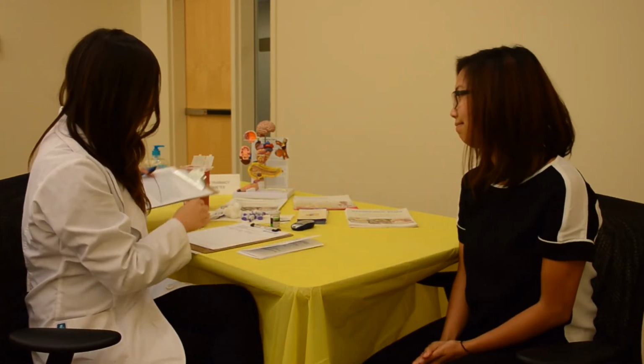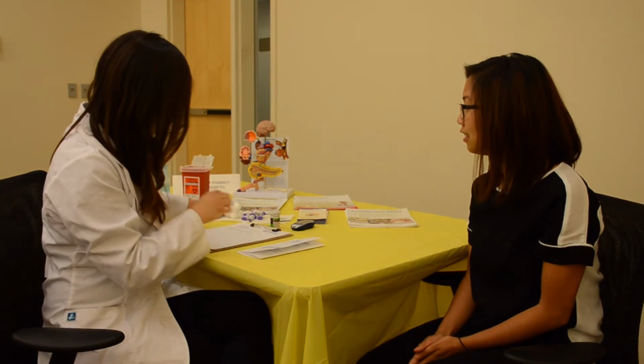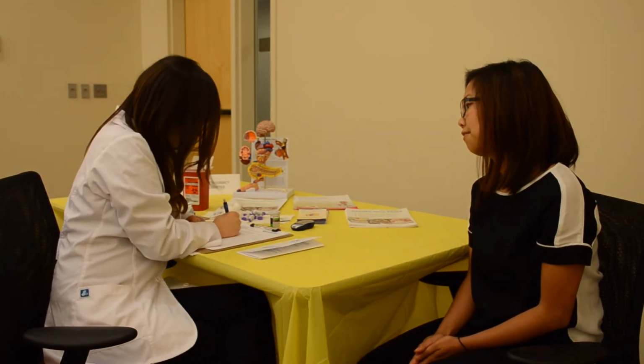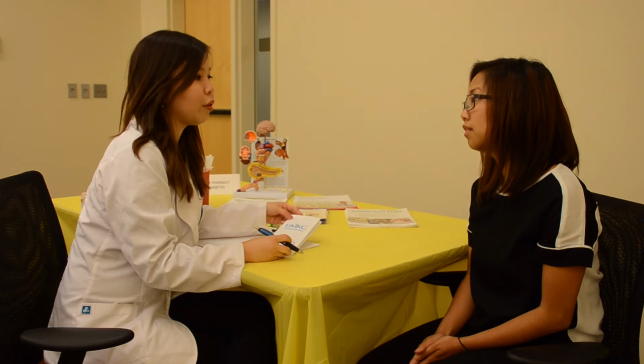Thank you, Julie. I'm going to ask you a few questions. Have you ever been diagnosed with diabetes before? No, I haven't. Okay. Have you eaten anything in the past 8 hours? No. Alrighty. So before we do the finger stick part, I'm going to have to go through this risk assessment form with you. Is it okay? Yeah, sure.